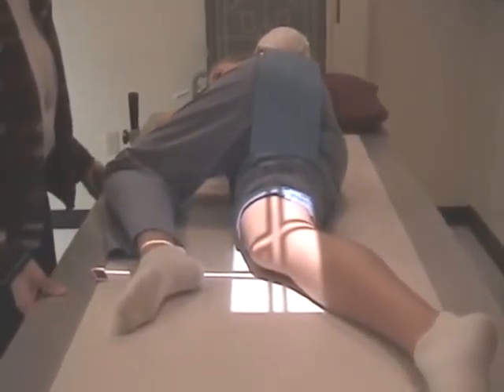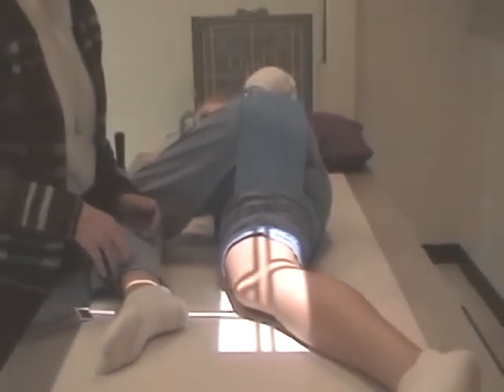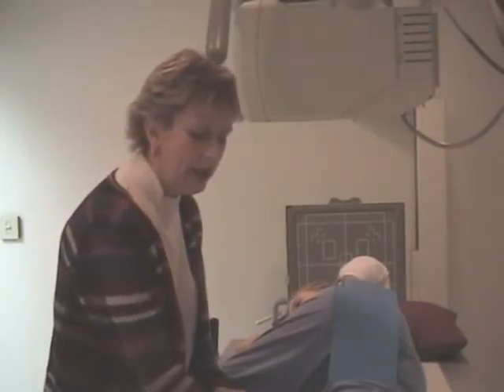There you go. I want the crosshair coming down the center of the femur. See how I've come down the center of the femur. Now I'm going to want you to watch what I'm going to do real close. I don't use the apex of the patella for a lateral centering mark because, feel on yourself, feel your patella with the legs straight, muscles relaxed, not tight. Now flex your leg slightly, keeping your muscles relaxed, and feel what your patella does.